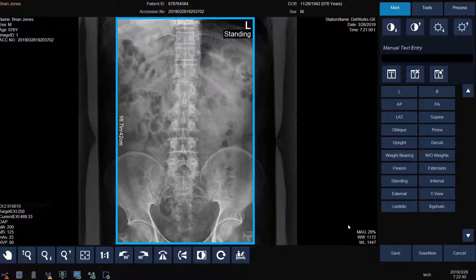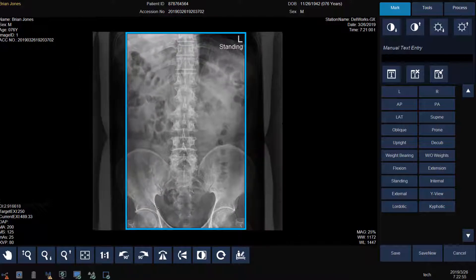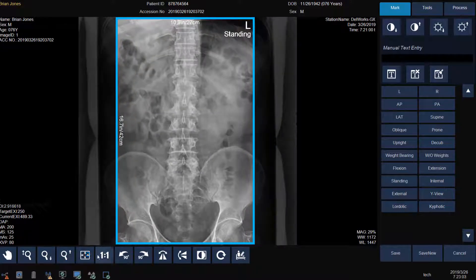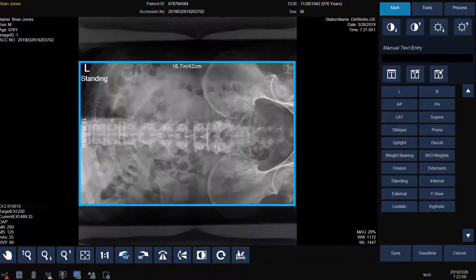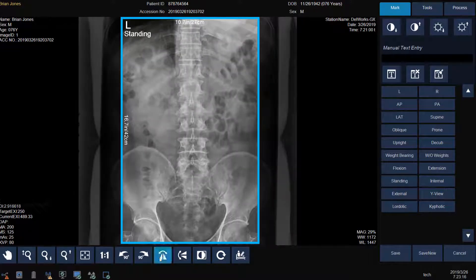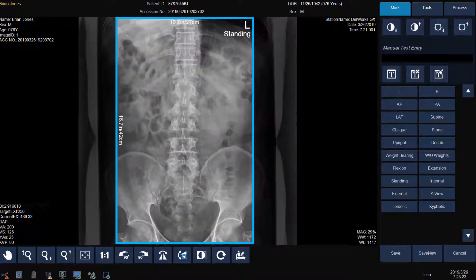Now we'll review some of the less commonly used tools. We can pan the image. We can zoom in or out. We can change the image display view — one to one or original size. We can rotate the image 90 degrees to the left or the right. We can flip the image horizontally or vertically. We can invert the image. Or we can reset the image to its original state.